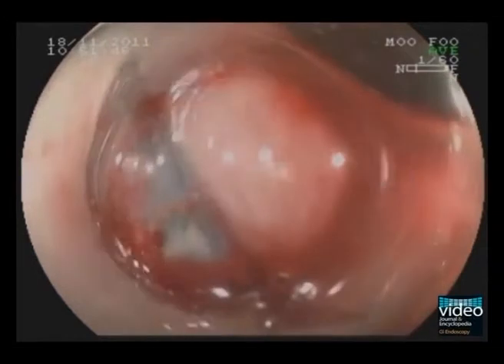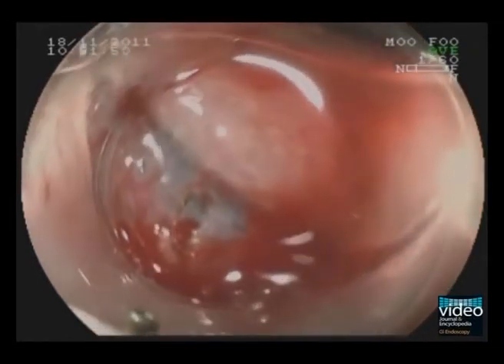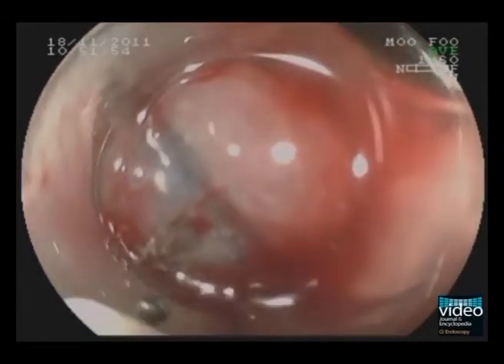We intend to perform a hybrid dissection, namely a circumferential cutting followed by snare resection. Therefore, the circumferential cutting has to be completed first.